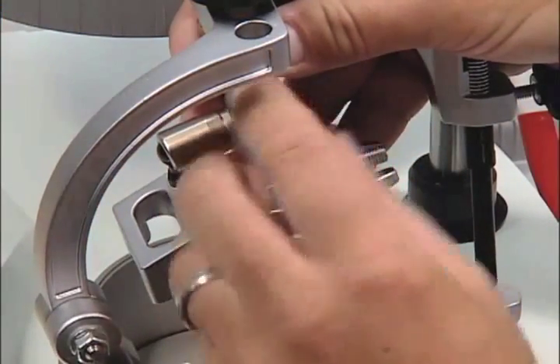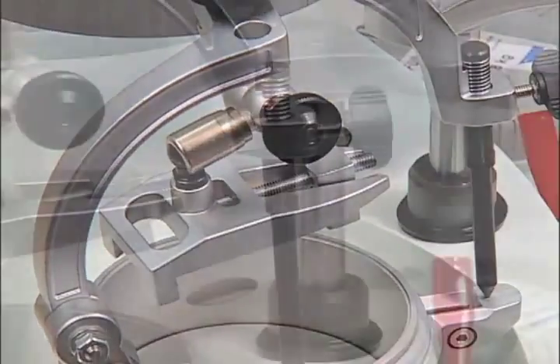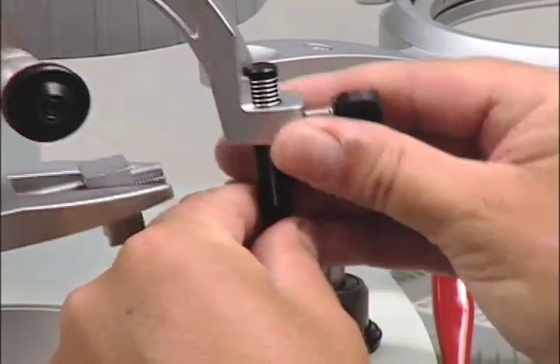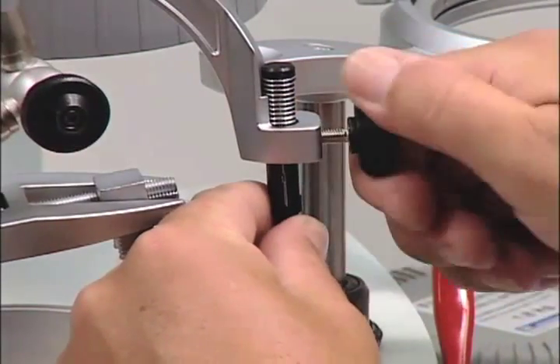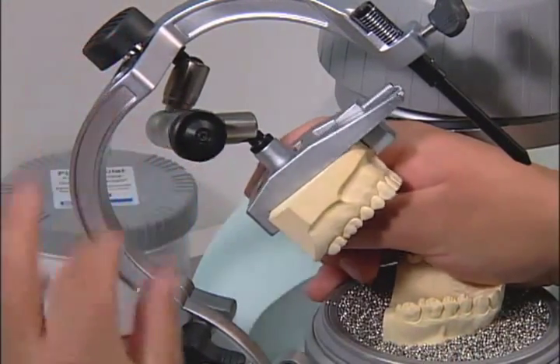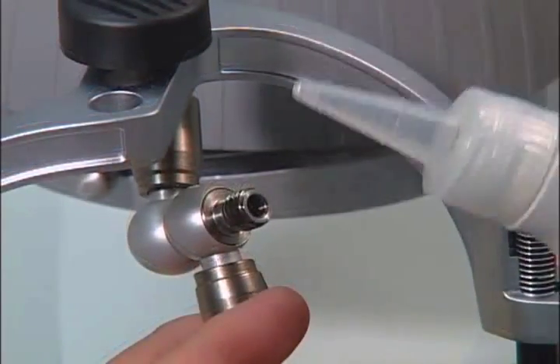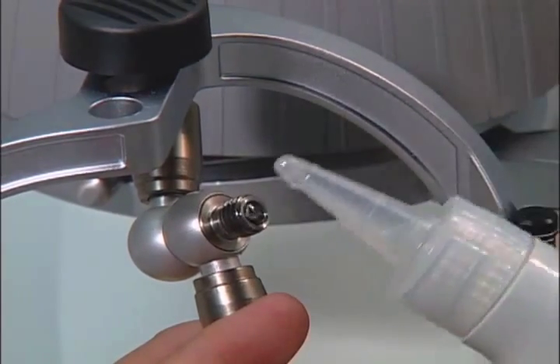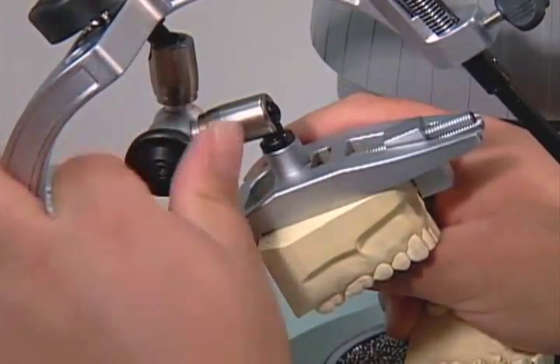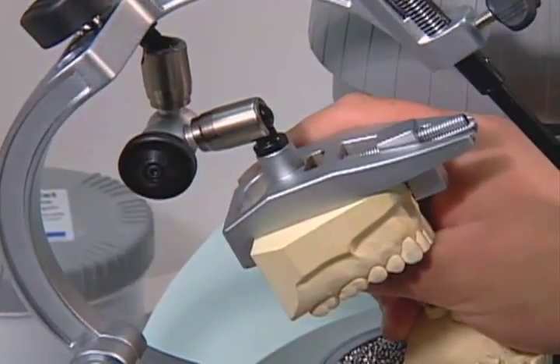Place the upper model plate into the highest position, which is the best starting position to articulate the models. Note that one scale line at the supporting pin is about 1 mm at the incisal point. When the arresting joint is not closing properly, oil needs to be added. Unscrew the black nut and pull it out. Use machinery oil to fill the tube 90% full. Screw the black nut back onto the unit and close the arresting joint to check that it is functioning properly. If not, there might be a leak in the system and it needs to be repaired.